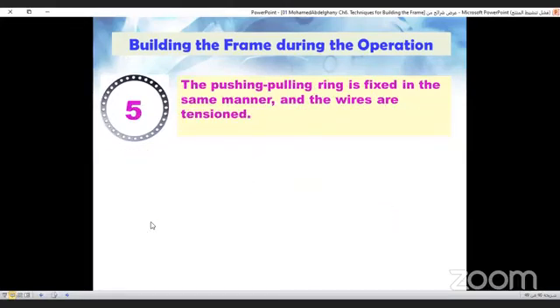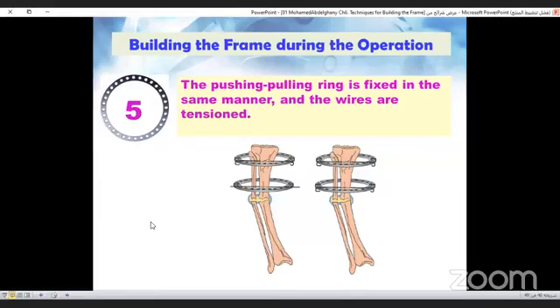In step five, we fix the pushing pulling ring in the same manner and then we tension the wires.